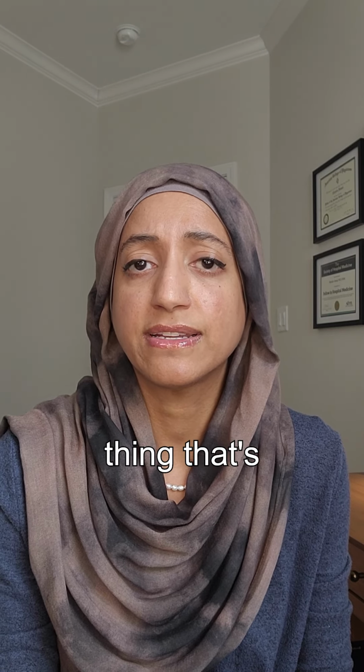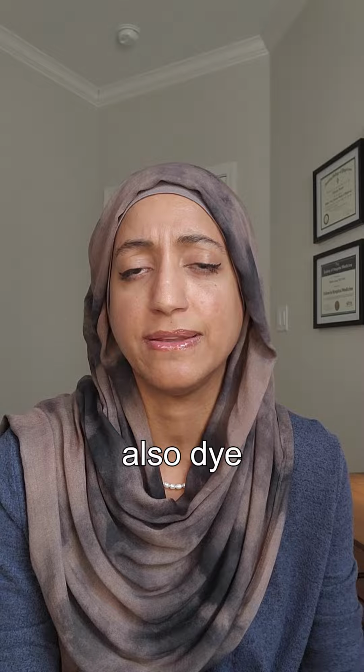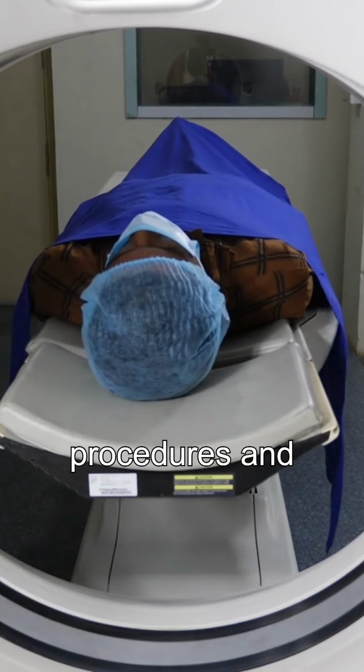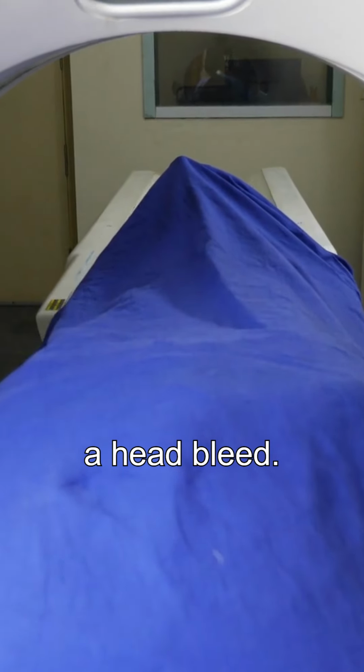What is the role of brain imaging in terms of a stroke? So once a patient comes to the ER with stroke-like symptoms, the first thing that's going to be done is a CT of the brain without contrast. Contrast is also dye that's used in radiologic procedures. And that serves to show that there's no intracranial hemorrhage or a head bleed.